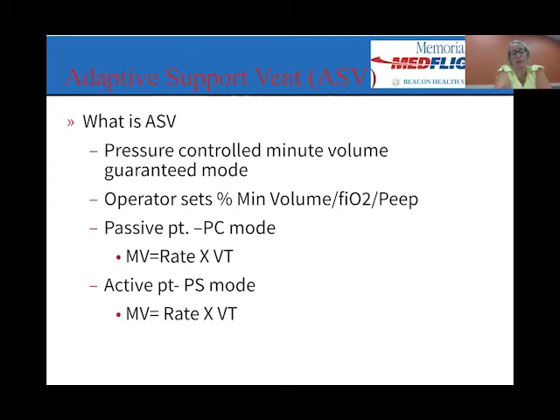So it will basically say, okay, you've got an ideal body weight of 80 kilos, and this should be your minute volume. The patient's not doing anything, so it's going to give a set rate based on the tidal volumes it's getting back. It's still going to allow the patient, it doesn't want to reach over a certain pressure that you set.